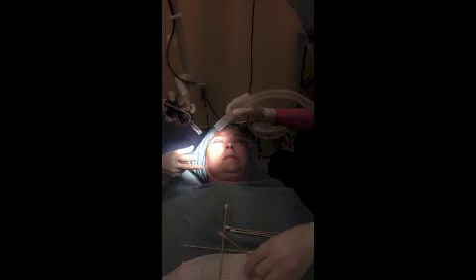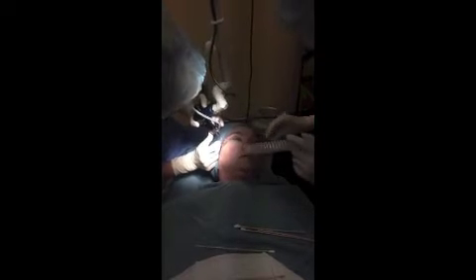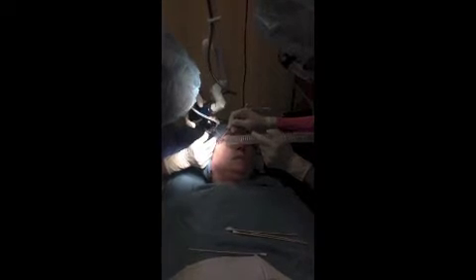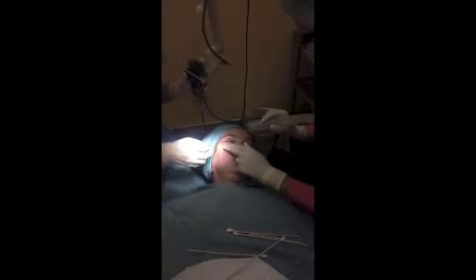Let me pull this out here. Turn that light on. And look up to the back wall — see there, you can pick off.